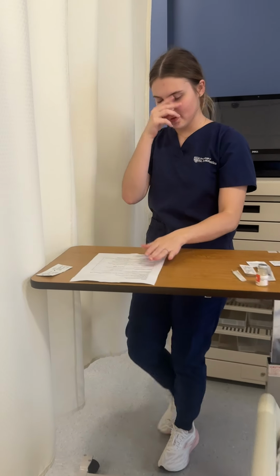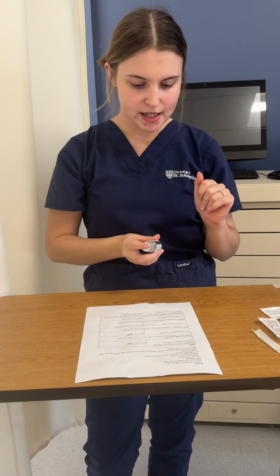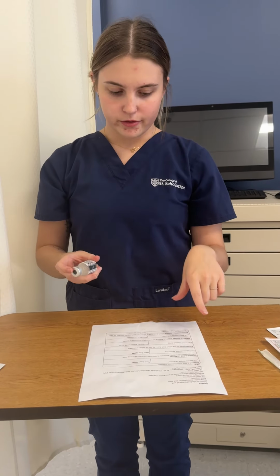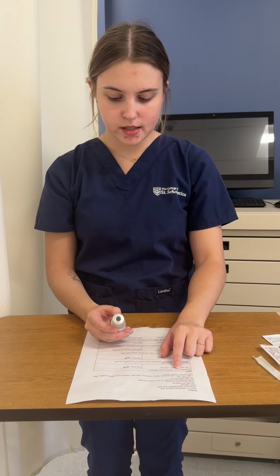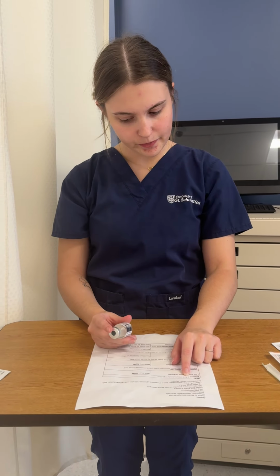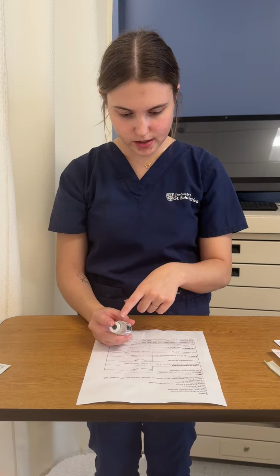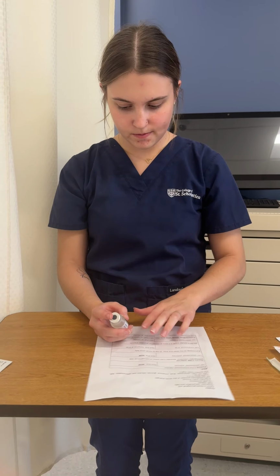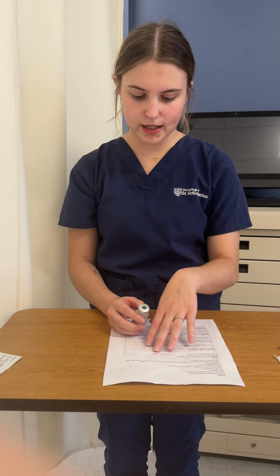So now we're back in the med room. We're gonna conduct our first med check for the flu shot. So we have flu shot. This is to prevent influenza. It is 0.5 milliliters for an IM injection. For Sam Johnson. It has not been administered yet, and so we're gonna give that now.